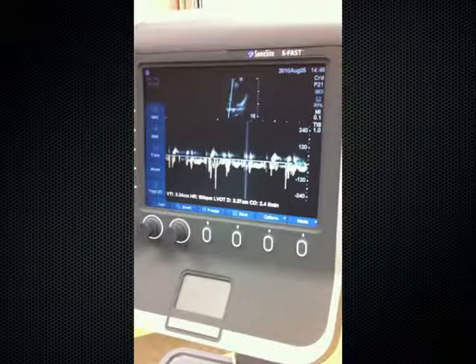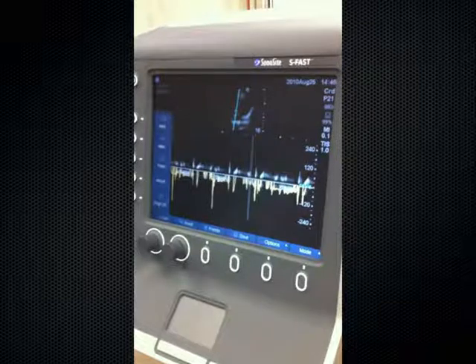Yes? So you have parabolic flow coming out, so when you do the gating, how large can you take the gate? Because depending where you are, you're going to have completely skewed. Yeah, so there's a sampling gate that you can make wider or skinnier, okay? That's a good question. I've been messing with that sampling gate. What he's asking about, that little TIE fighter, you can spread out its wings, if you will, further apart or more narrow, and that changes your waveform quite a bit. So that's something we've got to mess around with. I'm not sure. This is all brand new stuff, so I don't know the exact answer to your question.